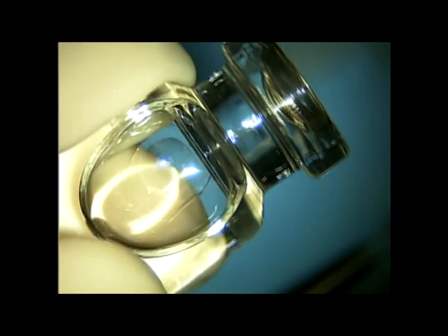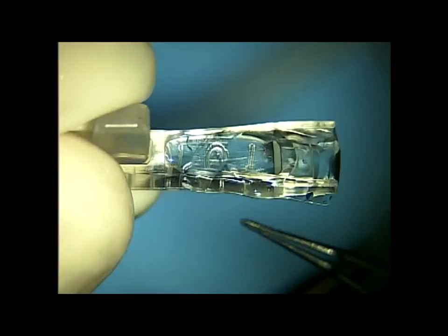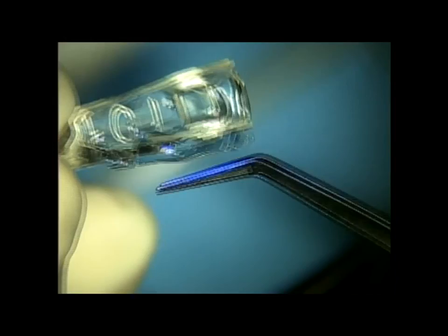Here's the Star ICL. I use a smooth non-toothed forceps to just grab it, shake it toward the front of the bottle, and then I grab one edge with a smooth .12 tying forceps. I then just place one edge into the channel of the insertion cartridge.